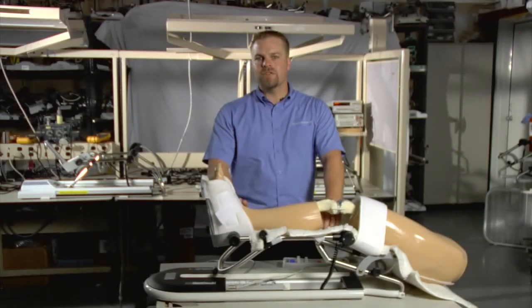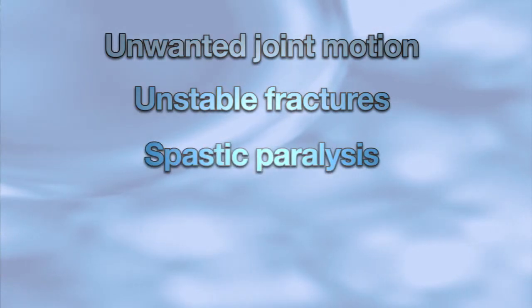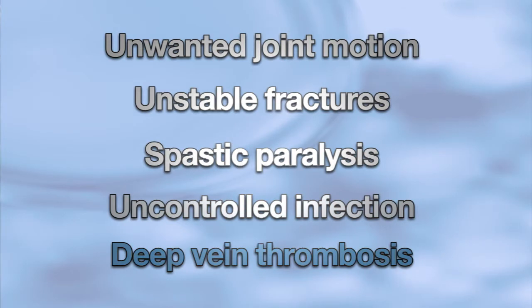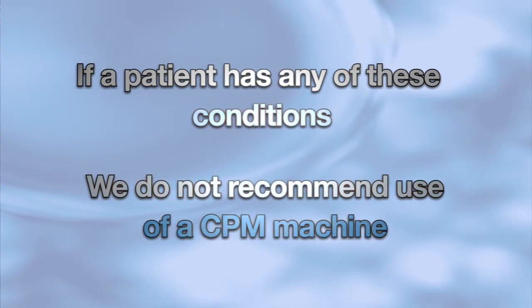So there are some contraindications with CPM therapy. One would be unwanted joint motion. Another would be unstable fractures, spastic paralysis, uncontrolled infection, or deep vein thrombosis. If a patient has any of these conditions, we would not recommend using the CPM machine.